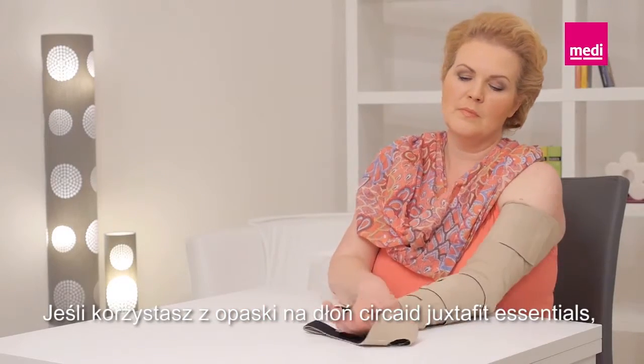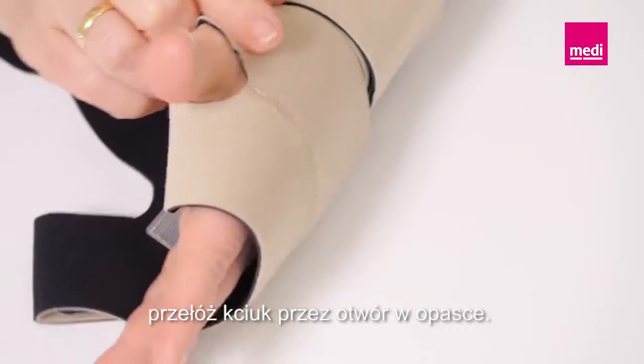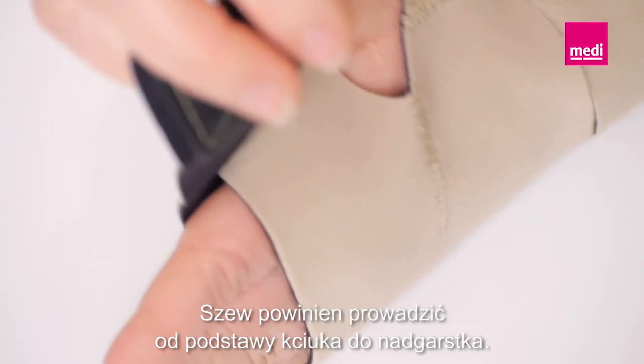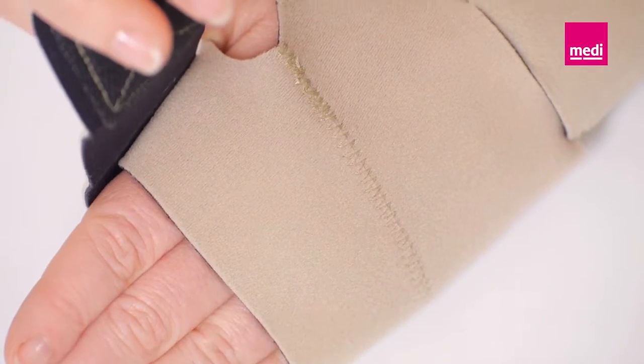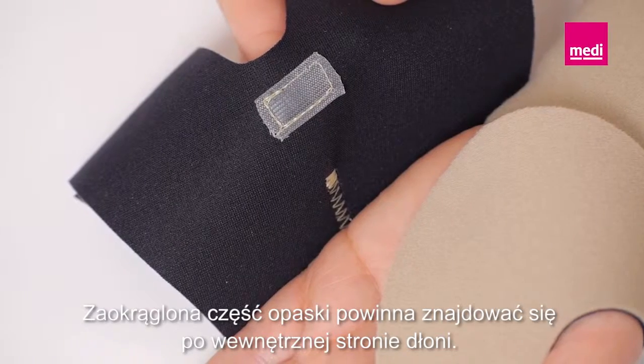If using the Circade Juxtafit Essentials hand wrap, slide the thumb through the hand wrap's thumb hole. The seam should run from the base of the thumb to the wrist. The curved portion of the wrap should be in the palm of the hand.